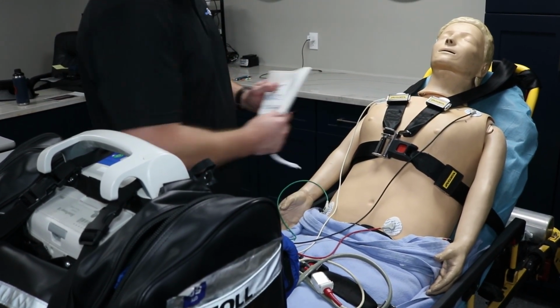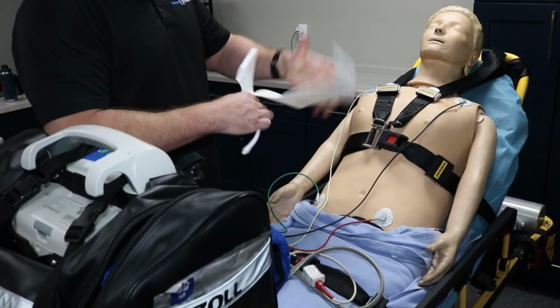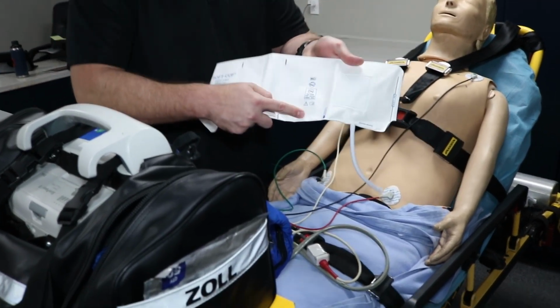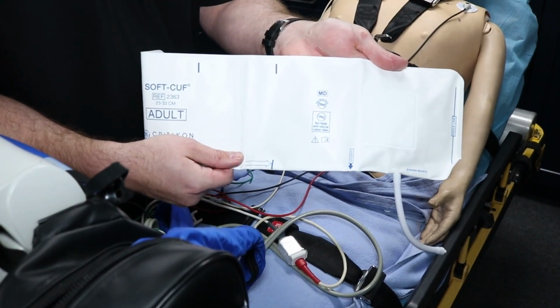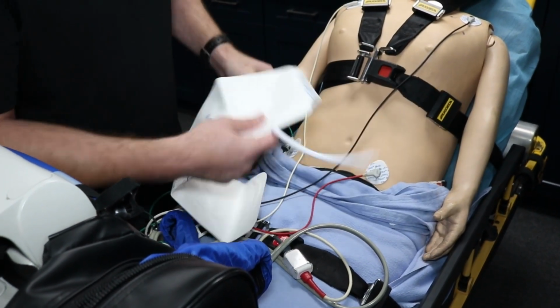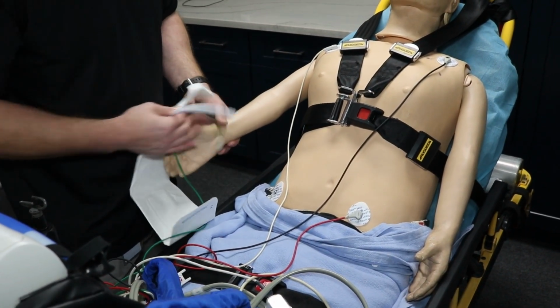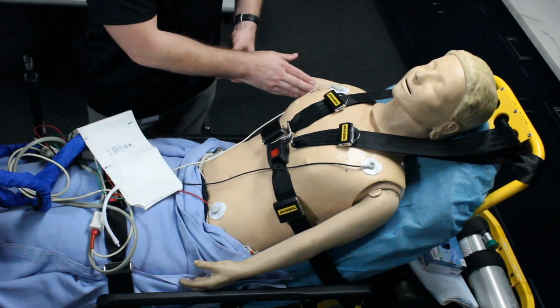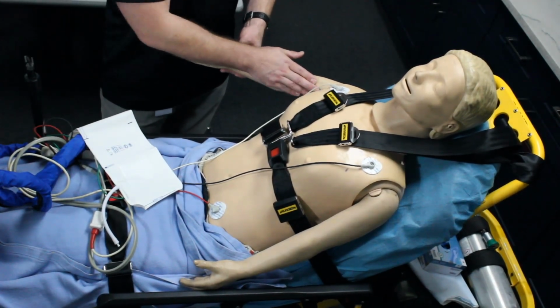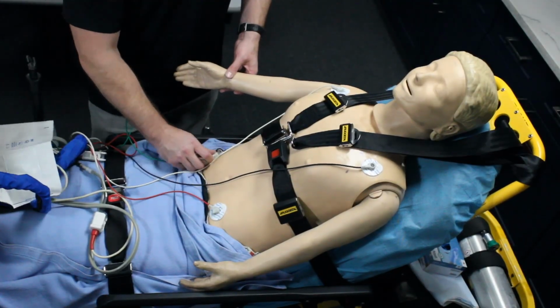Today we're going to hook up a patient on the right side here using the adult pad. Make sure when you are hooking it up, there is a label here for the artery, which we want to make sure is in line with our patient's artery here. That's that basilic artery here, right? Sorry, brachial artery.